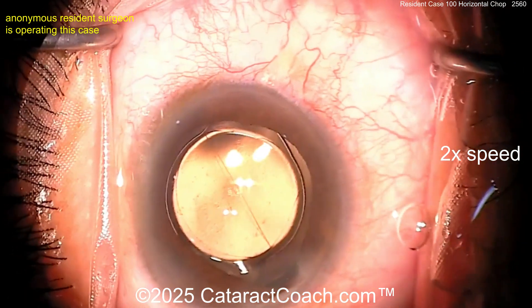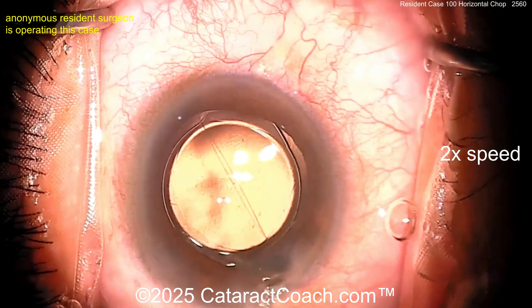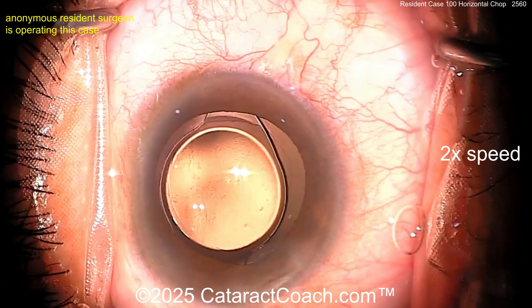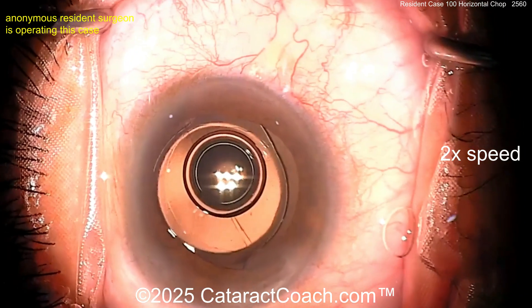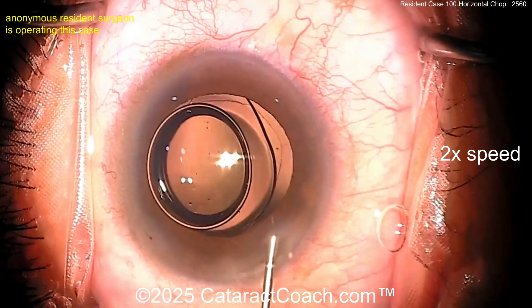The other improvement: when removing cortex, try a little bit more circumferential approach instead of stripping radially one half clock hour at a time — go circumferential for two or three clock hours. Then there's a little bit of iris prolapse in the incision, so be very careful. Get that back in the eye gently — just flatten out the eye a little bit, release that pressure gradient, and it goes back inside.